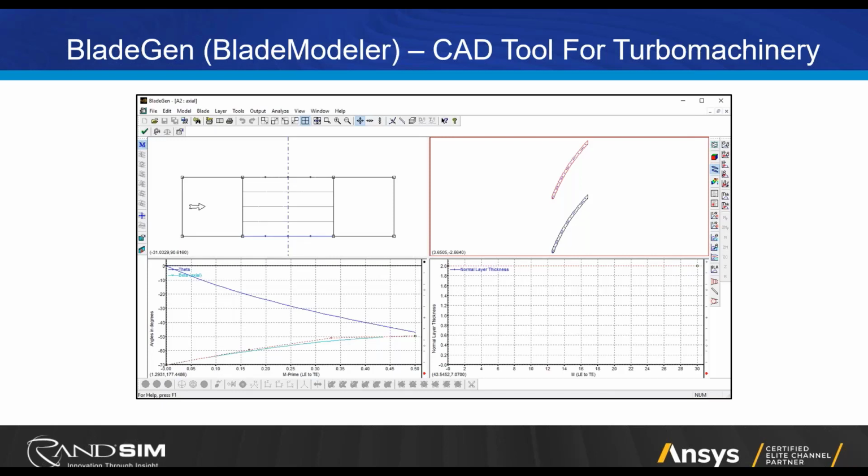Okay, and then the lower right, you can also vary the thickness of the blade in that view from hub to shroud. So there's different layers, right? What you see, you can define the number of layers between the hub and shroud, so it can vary its dimensions, you know, its geometry, shape between the hub and shroud, or it can be linear. And so this is just where you vary the thickness in the lower right. So again, it's very non-traditional. You may not have ever seen anything like this, but these are very familiar views for turbo design engineers. So that's why it was developed just specifically for this industry.